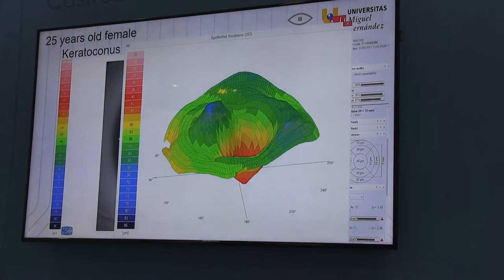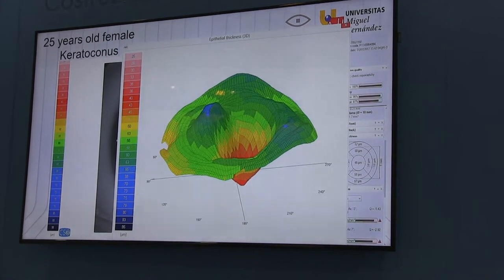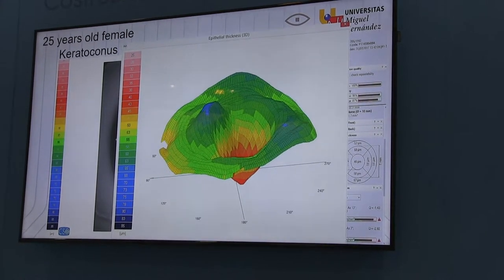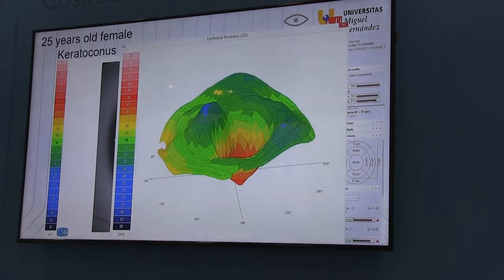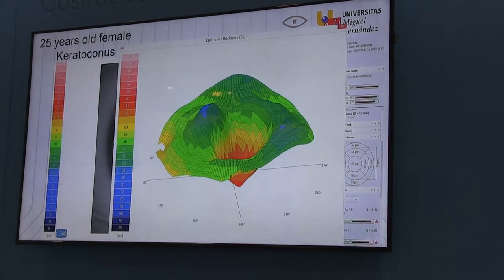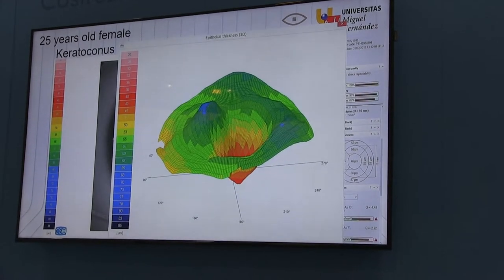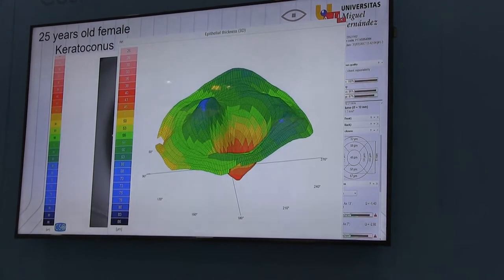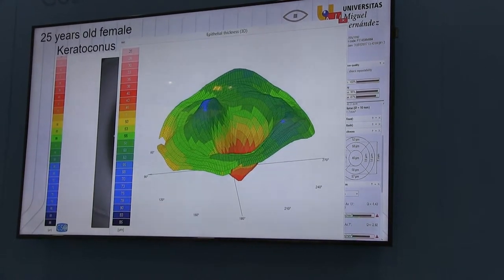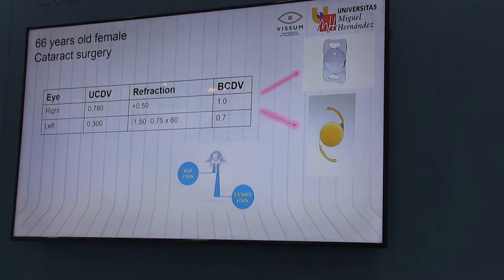You can see this in every single case of keratoconus — more or less — but it's an inverted profile. This inverted profile is a Mexican hat profile. It's typical of keratoconus, even in early stages, though not always that remarkable.